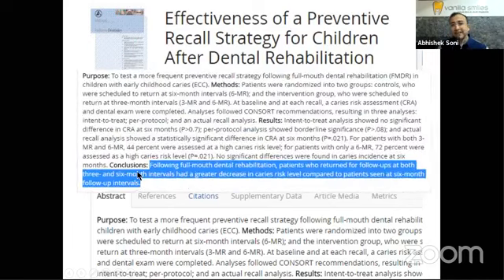So that's the operating room workflow. That's the operating room armamentarium layout. And let's look at a 2.9-year-old being managed in a span of 3 hours. The score was 16 teeth out of 20 that needed attention. And that's how we can provide quality dental care under general anesthesia.